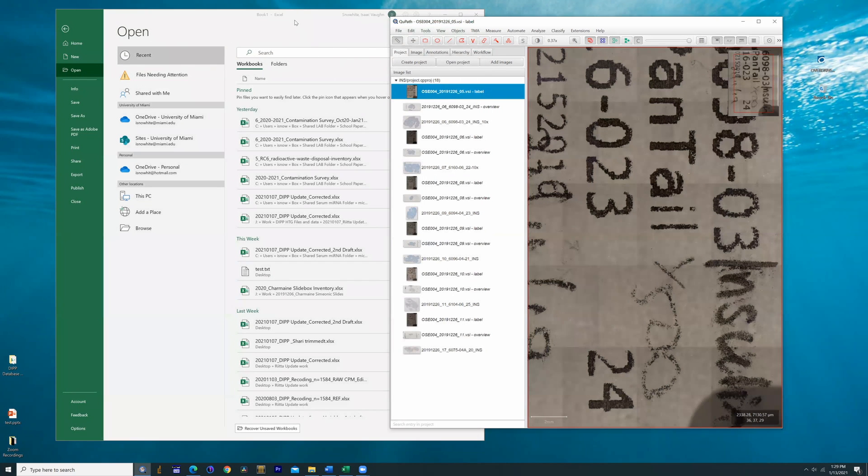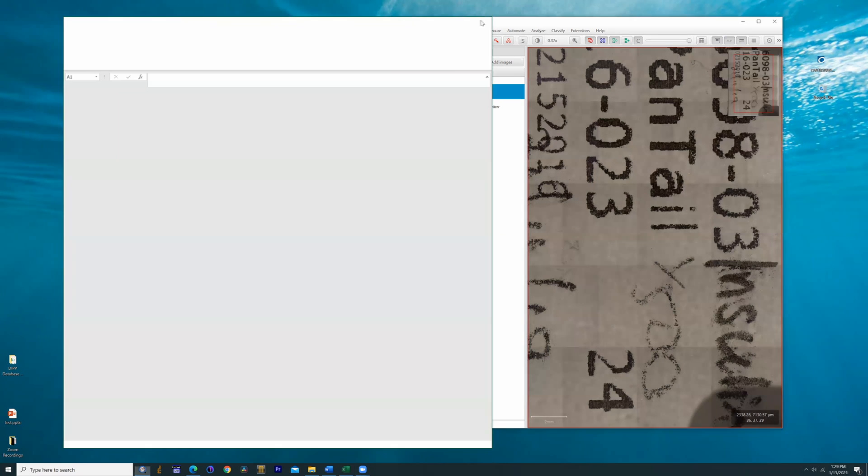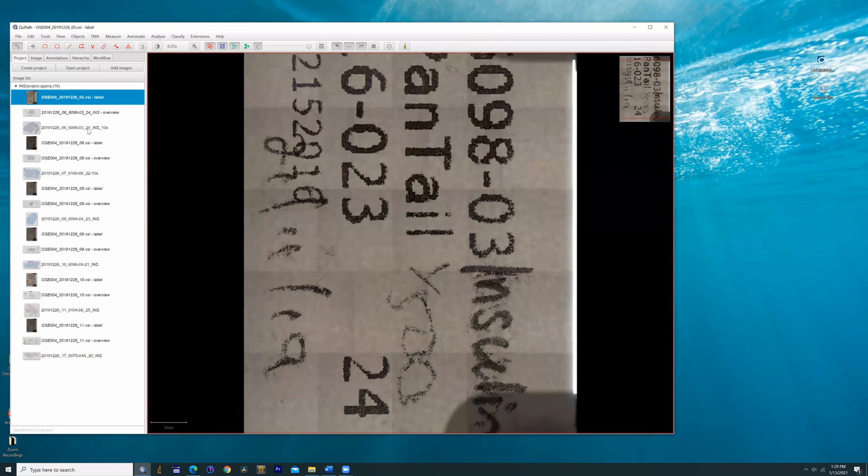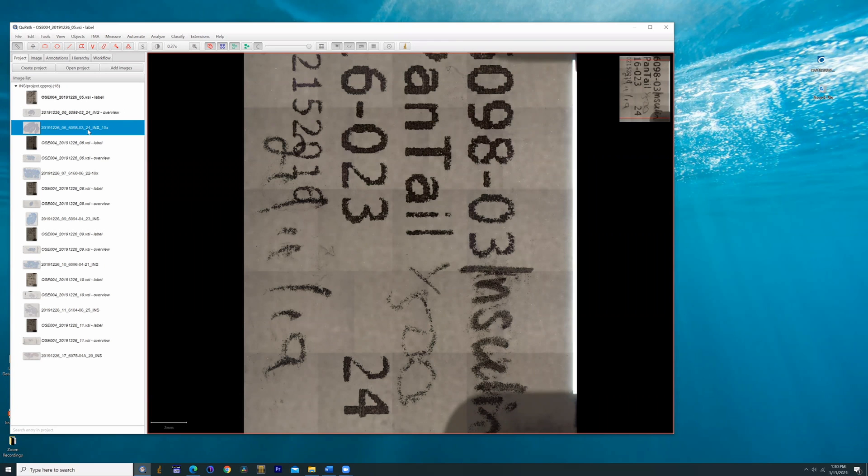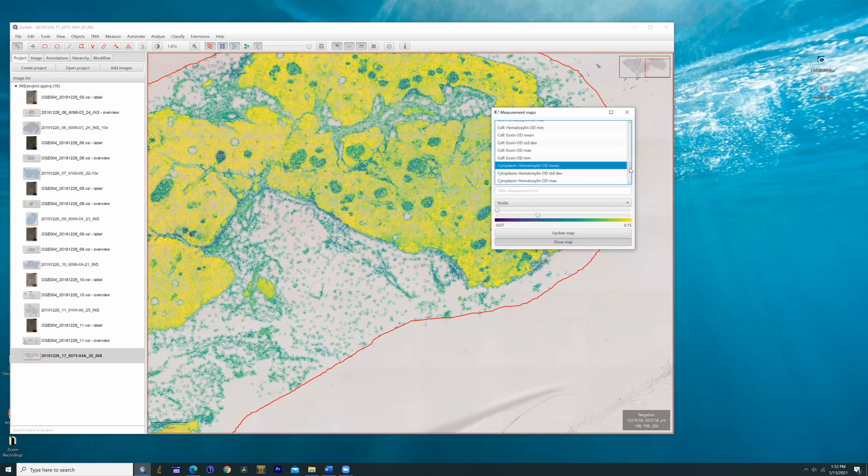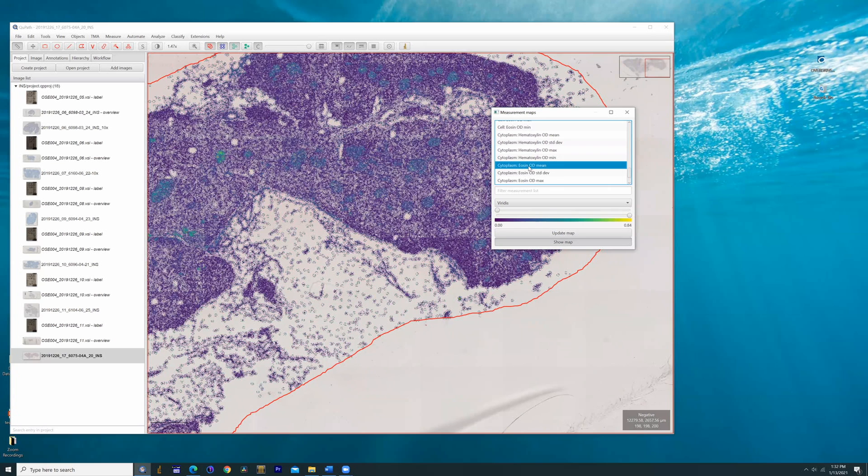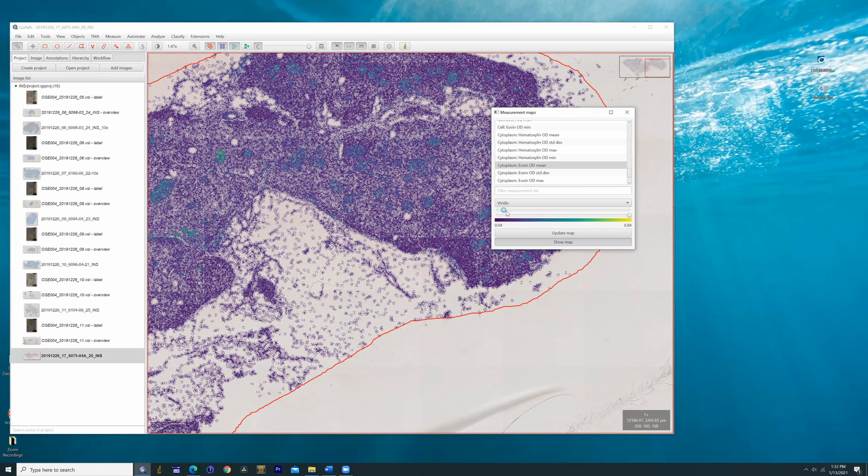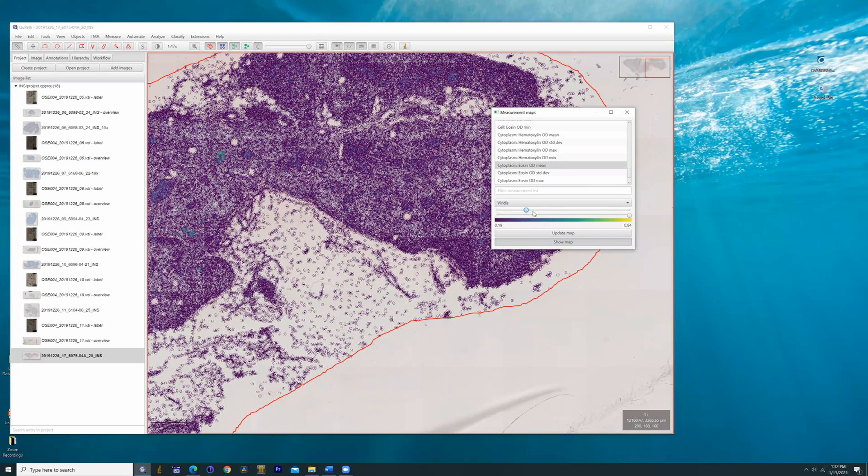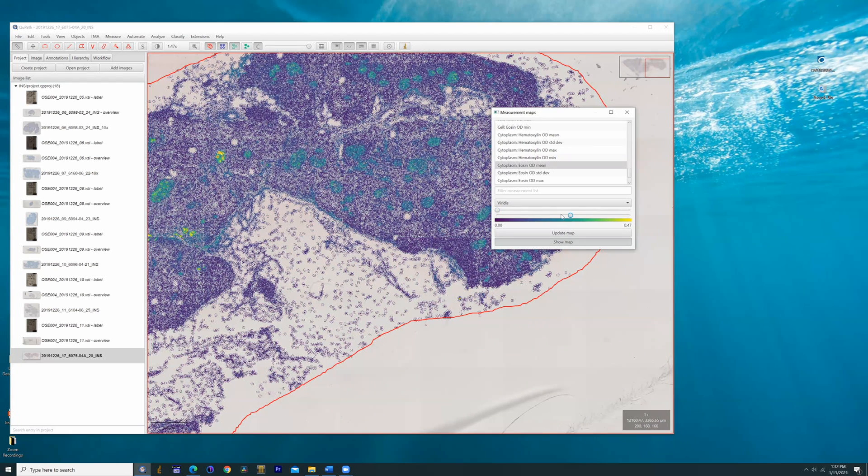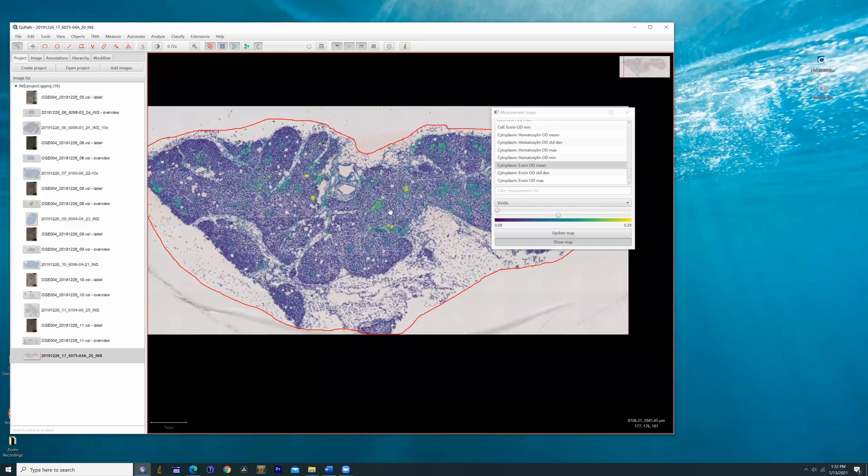Now, with that being said, there are several other interesting features I've stumbled upon within QPath. So if we were to say, I don't know, click on a section, open it up. Oh sorry, this is hematoxylin, that's the problem. I'm going to do eosin. So in this case, sorry, let me try again. In this case, we're looking at eosin staining. We have a lower threshold, the bulk of the tissue, the extroverted tissue isn't going to label, but you can raise the background to sort of cancel that out. Here we can lower the upper threshold. And so you can sort of intensify the color coming from the eosin.